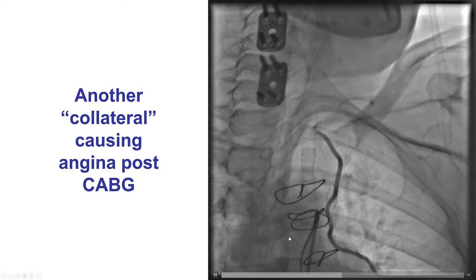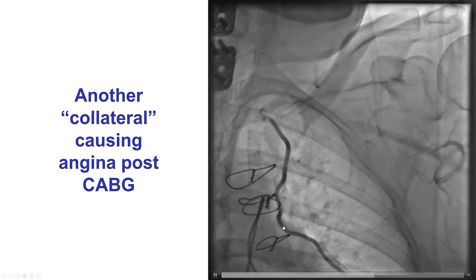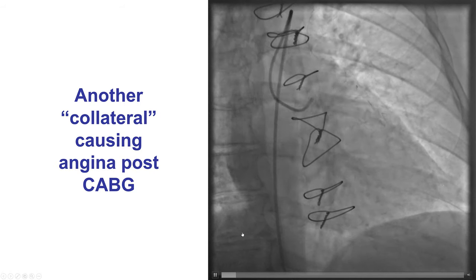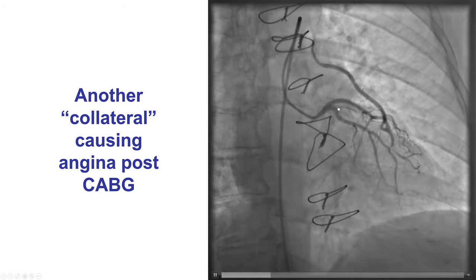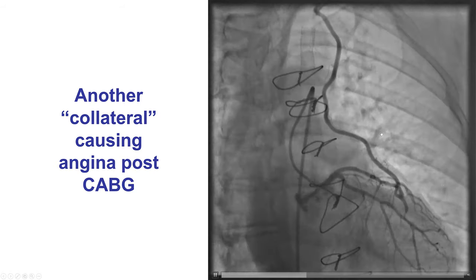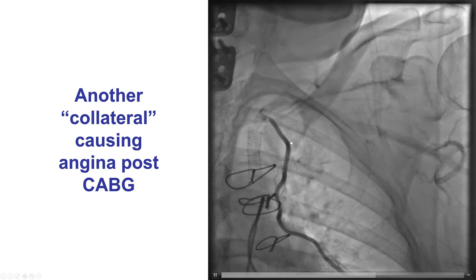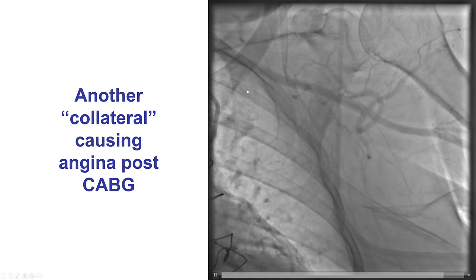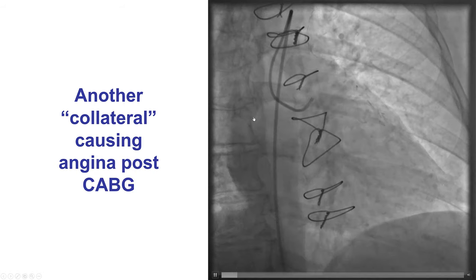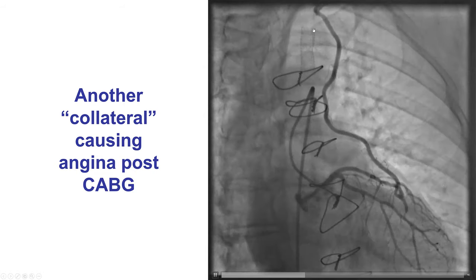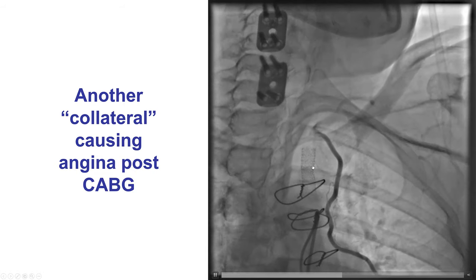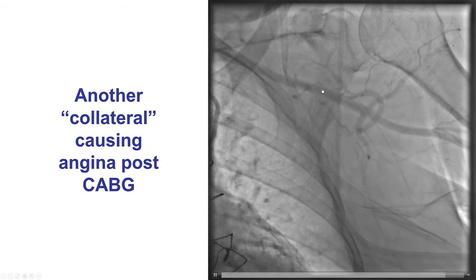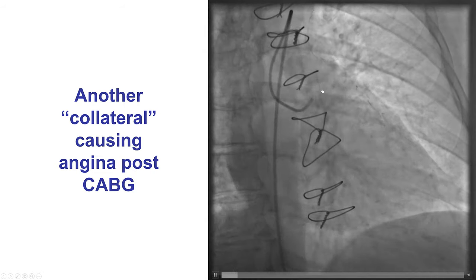Here is an example that resembles a collateral but is not: there is filling of the LAD and then retrograde filling into the LIMA and the arm. The reason for this finding is significant proximal subclavian stenosis — this is an example of subclavian steal.